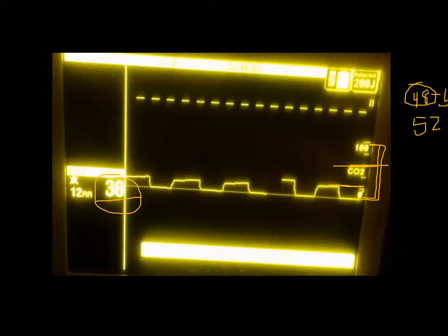And you're going to see nice, big, huge boxes. And then next thing you know, or maybe you don't realize it, the CO2 has gone up briefly to 52, and it's going to auto scale, and the scale is going to be 0 to 100. And next thing you know, you're going to see a huge change in your boxes. All of a sudden, now you have these small boxes where you had these large boxes before.